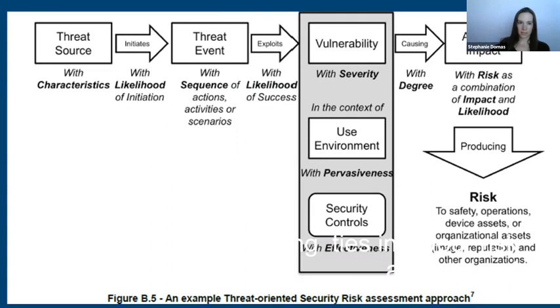And this one is all about thinking about the threat sources first, and we'll go into a little more detail of what each of these means. But the idea is you start with the threat sources and you're thinking about where all my threats come from and what it is they might want to do to my system, and that's where your threats originate.